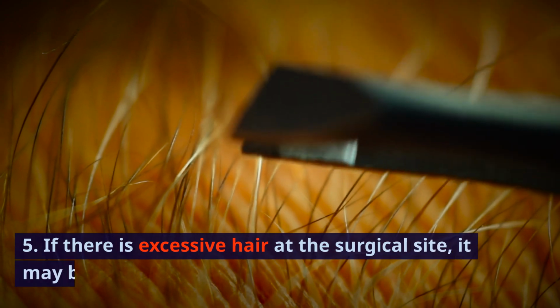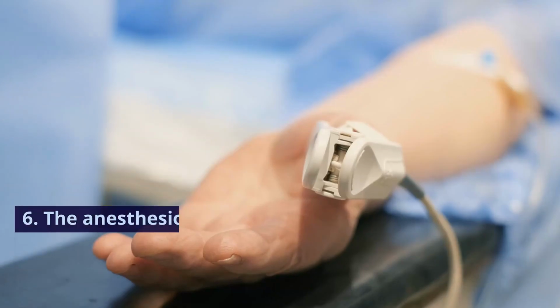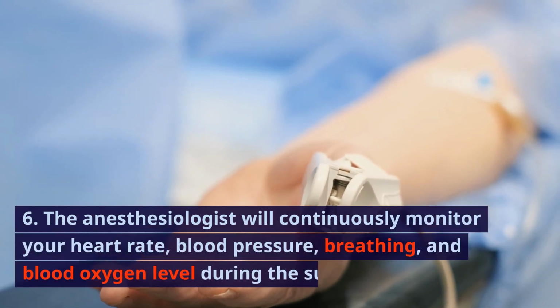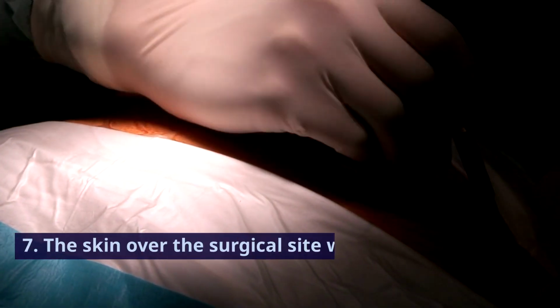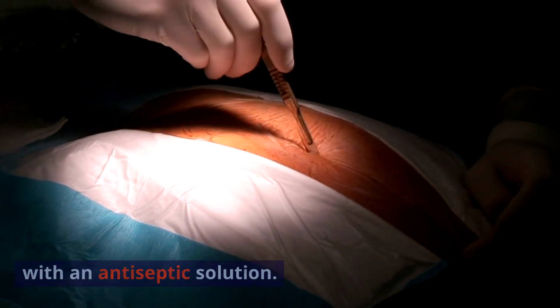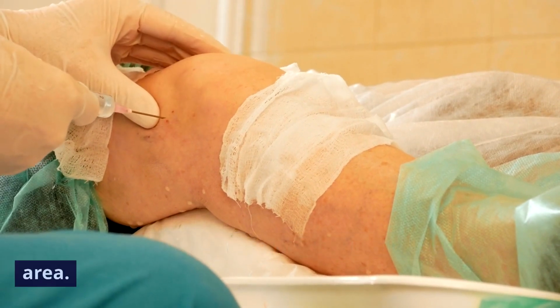If there is excessive hair at the surgical site, it may be clipped off. 6. The anesthesiologist will continuously monitor your heart rate, blood pressure, breathing, and blood oxygen level during the surgery. 7. The skin over the surgical site will be cleansed with an antiseptic solution. 8. The doctor will make an incision in the knee area.